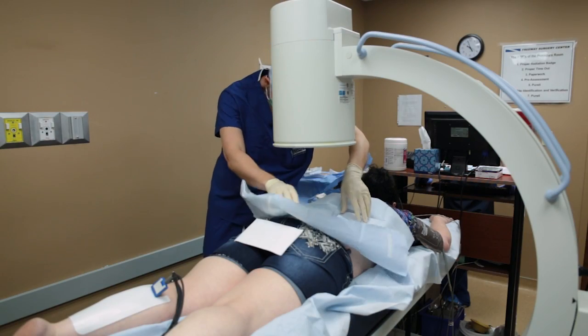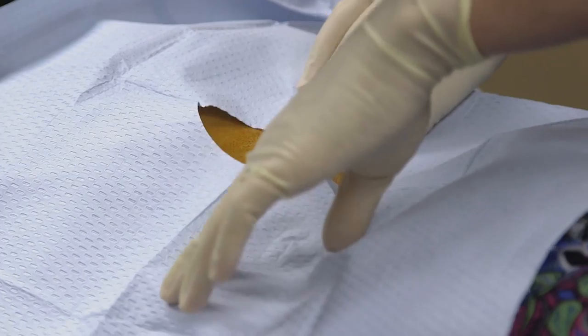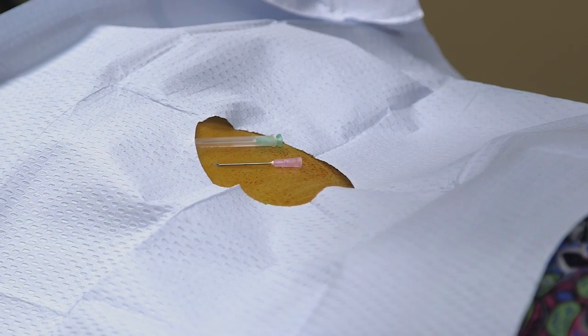After the procedure, if you do develop a headache please notify our office as soon as possible. The first part of the procedure, we're going to clean your back. Next we're going to use x-ray to help us localize the site for the rhizotomy.